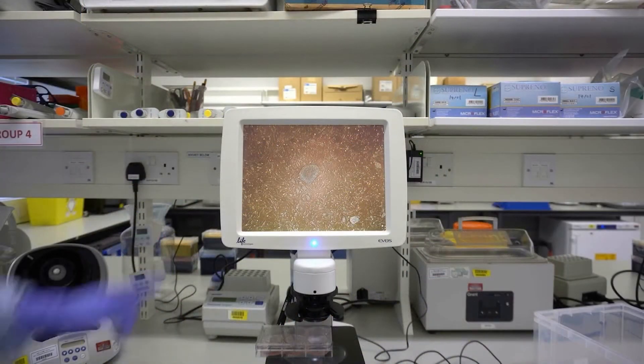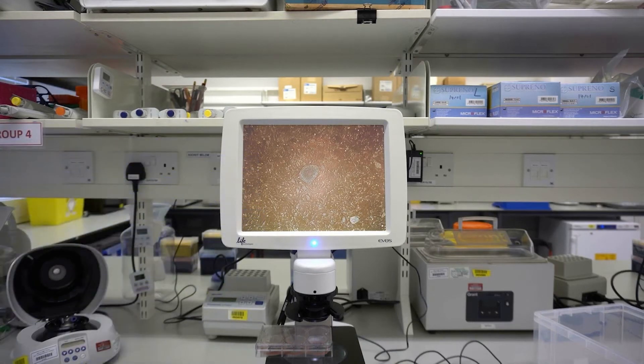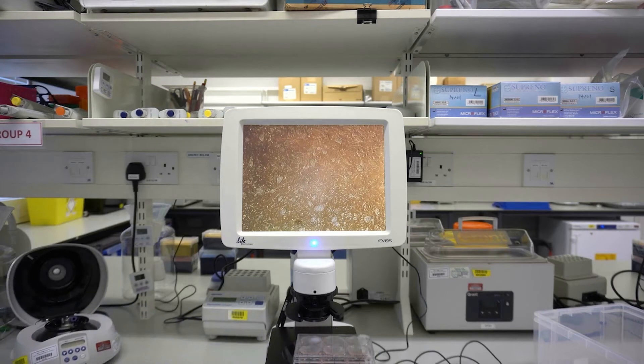Surrounding the colony there are many mouse embryonic fibroblasts, or MEFs. This second example has more colonies but they are much smaller. The edges are less defined and they are quite close together, which would make colony picking more difficult.